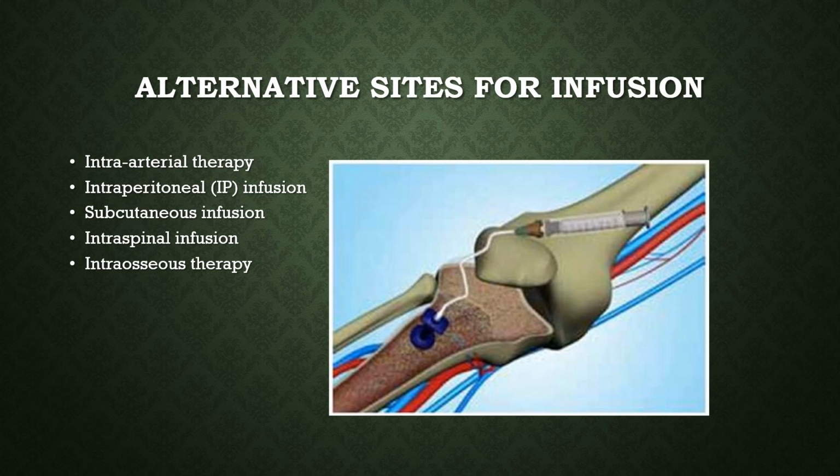Intraosseous therapy, and I'll be honest, I've not ever seen this, but they use large bones to access blood when they need to give fluids very quickly. That is done by paramedics, and it can also be done in the ER or by physicians. But if you ever get a chance to see it, some of you guys may have seen it. I have not. Intraosseous therapy.